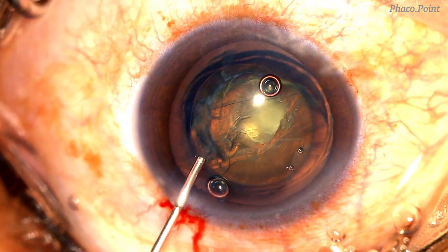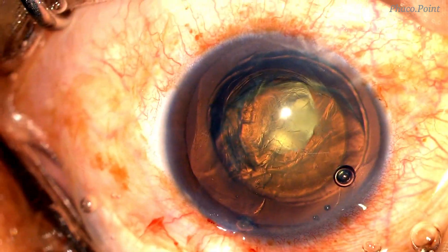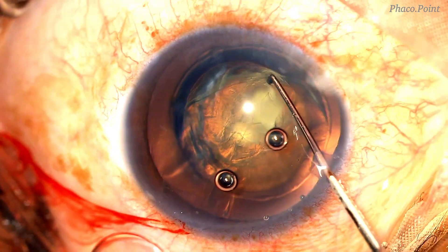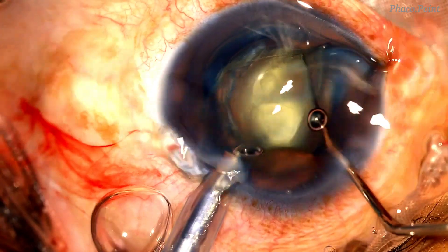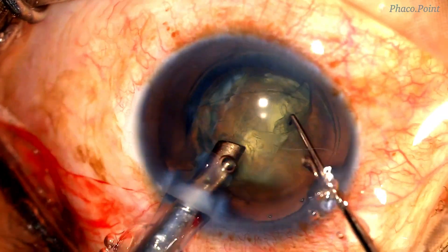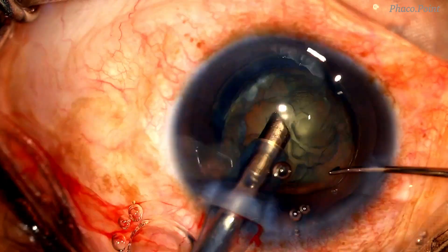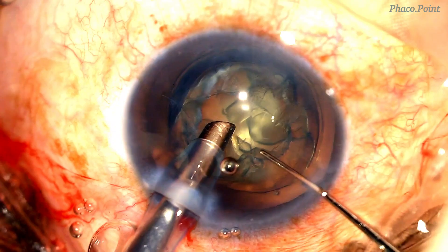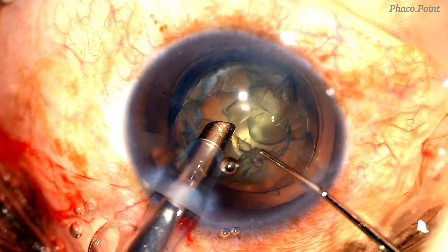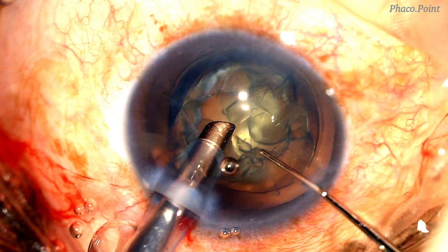We then introduce some viscoelastic into the anterior chamber prior to phaco emulsification. We work with very low flow settings: a power of 15 to 20% because this is a soft cataract, a vacuum of about 250 mmHg, and a flow rate as low as 22 to 24 cc per minute — because this is an even more compromised case of a polar cataract with a pre-existing rent in the posterior capsule.